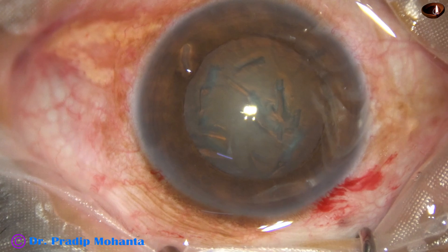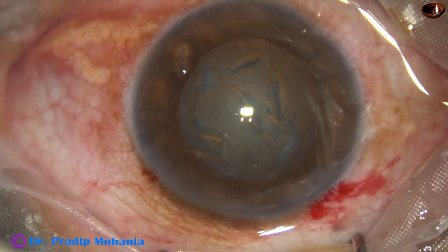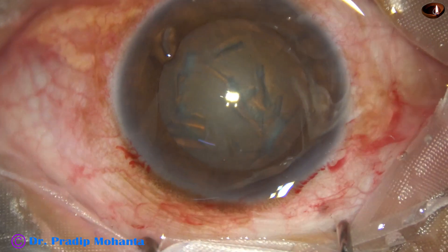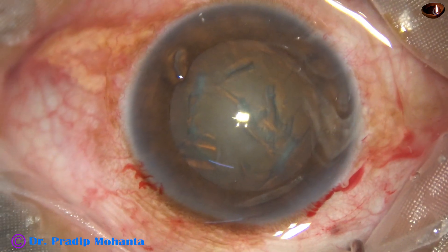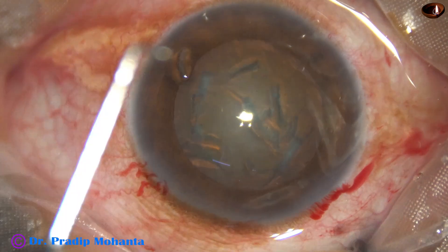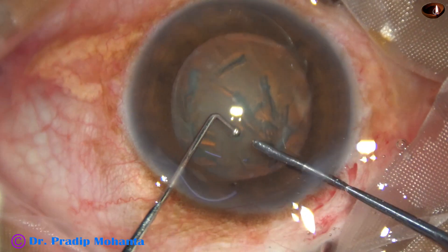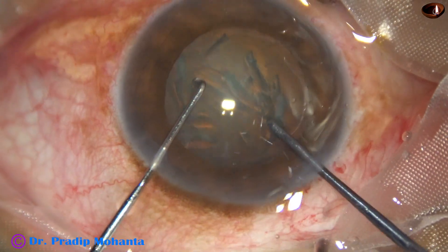The anterior chamber is again filled up with viscoelastic — 2% HPMC. And now we are going to divide this nucleus into 4 pieces with this pre-chopper designed by Dr. Sohail Irfan Khan.